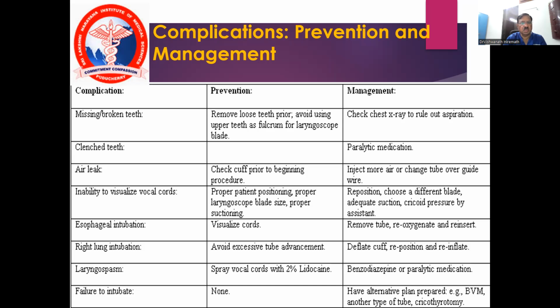Full buck teeth, it will be difficult. Air leak: check the cuff prior to beginning the procedure.